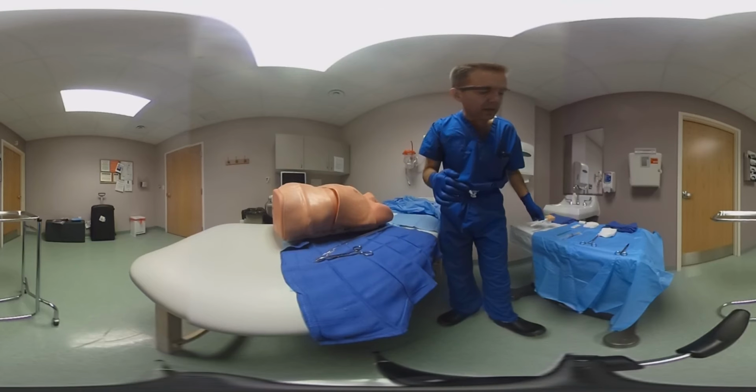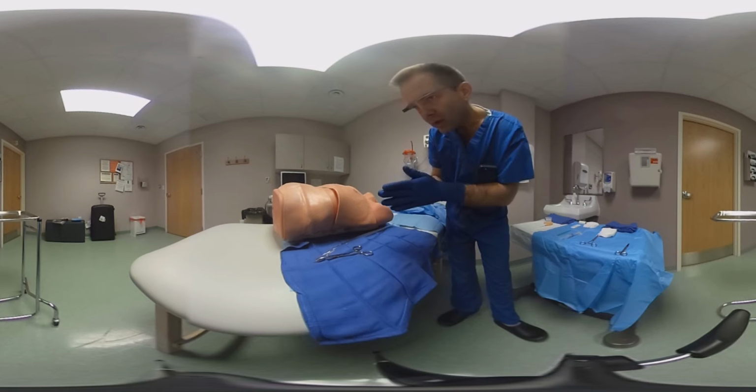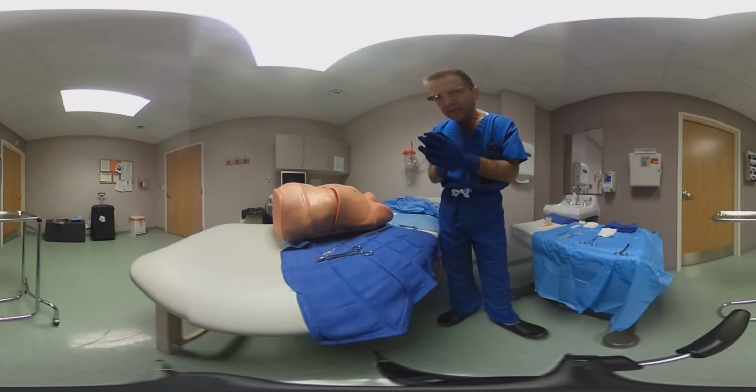It's very important that you keep proper precautions to make the procedure a clean procedure, because infection of the pleural cavity is a very significant morbidity, a significant complication. You can develop basically empyema, which is pus in the pleural cavity, which has a high morbidity and possibly even mortality.